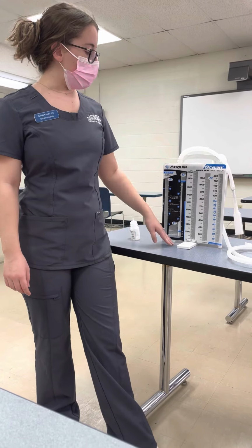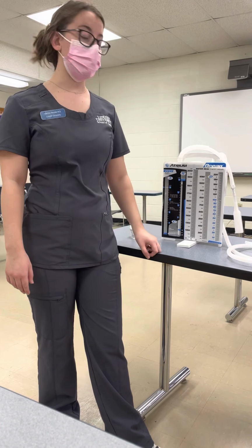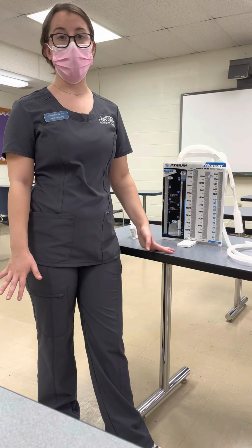And another thing we can assess for is crepitus. We would see that as the air under the skin. We do not want that to happen, so we can assess the drainage site and palpate that, and if we feel it, then we would definitely need to notify the provider because that is not normal.